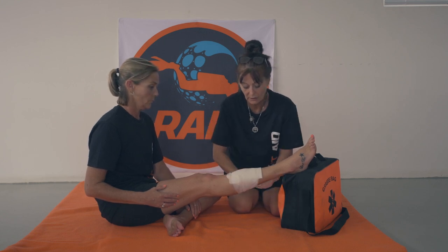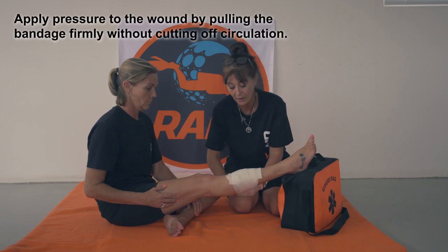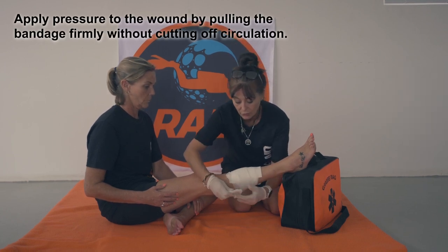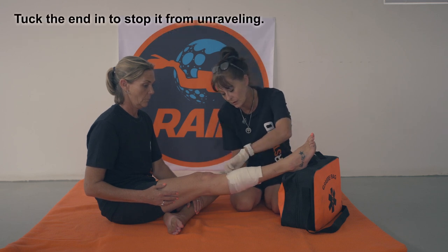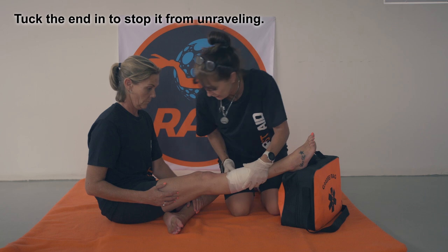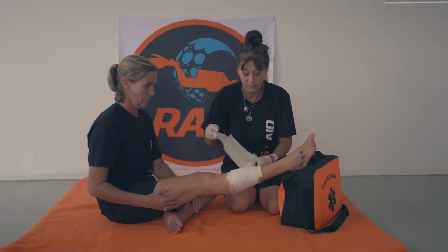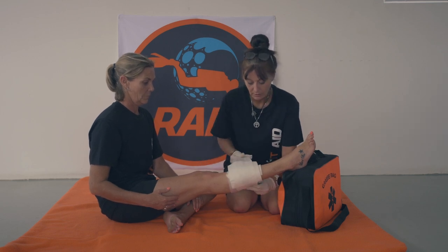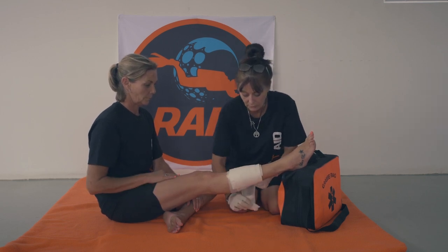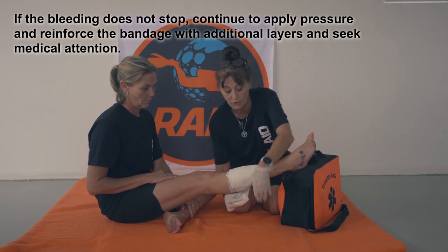If you happen to see that your blood is still seeping through, you may need to apply another bandage. I will show you now. All right, so we're going to tuck this in. And I do see that there is still blood seeping through, so I will apply another one back onto the spot. And we just apply a lot of pressure onto the open wound.